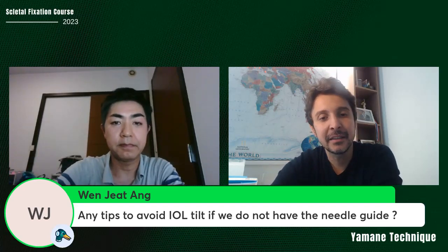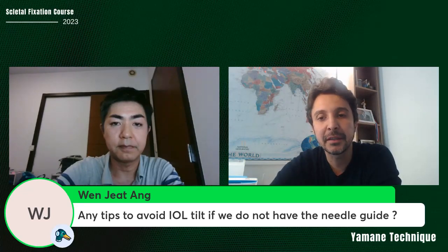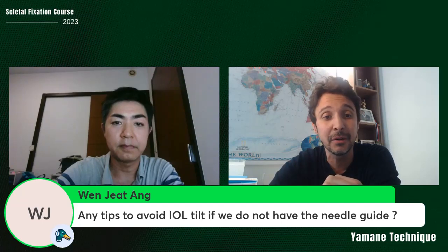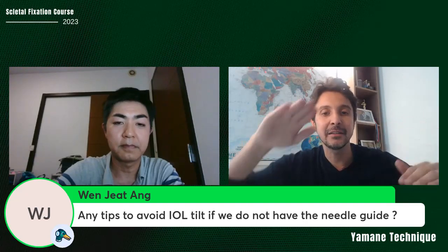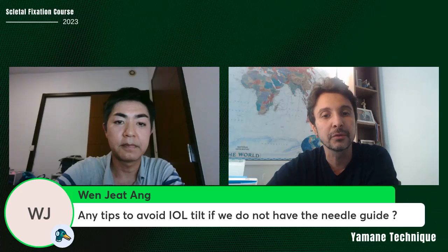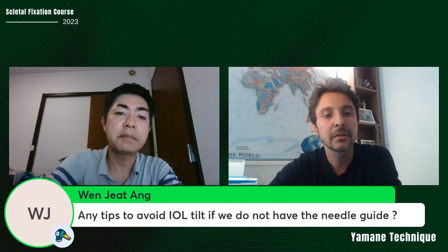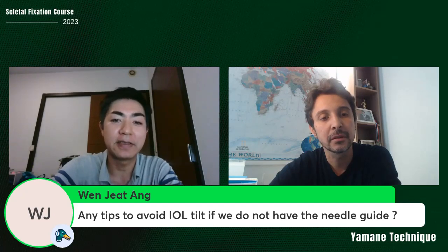Shin, I think the tip that you discussed about balancing the haptic in the single needle technique is a good tip, because I saw in the video that when the surgeon does the single needle, sometimes it cannot have a balanced externalization, it can tilt, right? I think these two tips were good, and cutting the haptic is a good option to keep the IOL more flat, right? Yes, that is an option, but the most important point is the insertion angle of the needles. The angle of the needle.